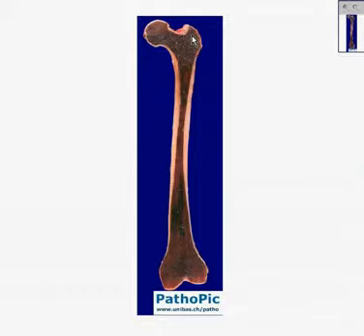If a marrow is expanded, perhaps due to leukemia, the marrow might involve the whole bone. Normal adult bone marrow in long bones is 100% fat. In here, you can see this is not fat at all. This looks like red hematopoietic marrow. But in this case, it's producing mostly the blast cells and has a relative suppression of the platelets and white cells.